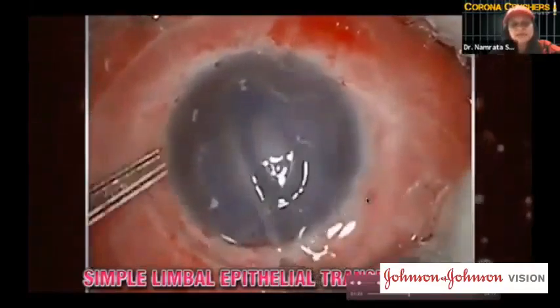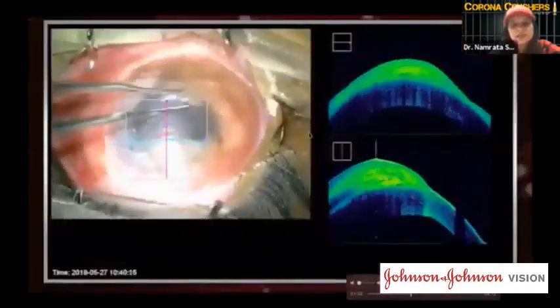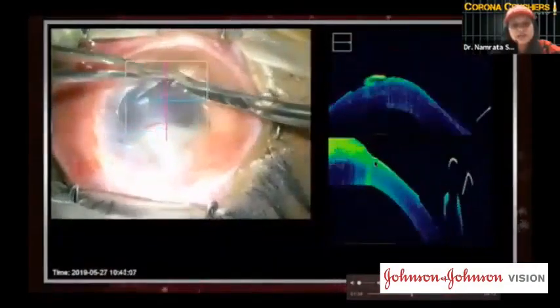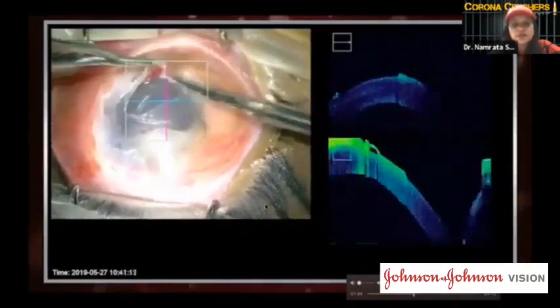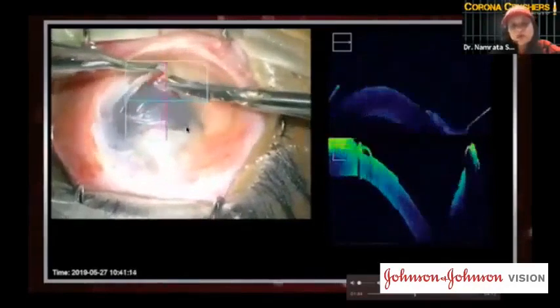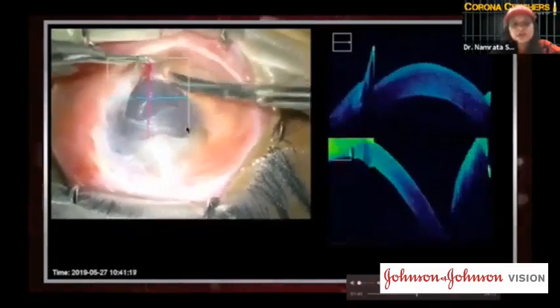Now, this is a very simple procedure. It is like a lab which is in the eye itself, and look at this patient. This is being done under intraop OCT microscope, hopping from clinic to clinic. But if you don't take that eye from there, then who's going to do it for the patient who's been just prescribed lubricants without actually having to do anything?